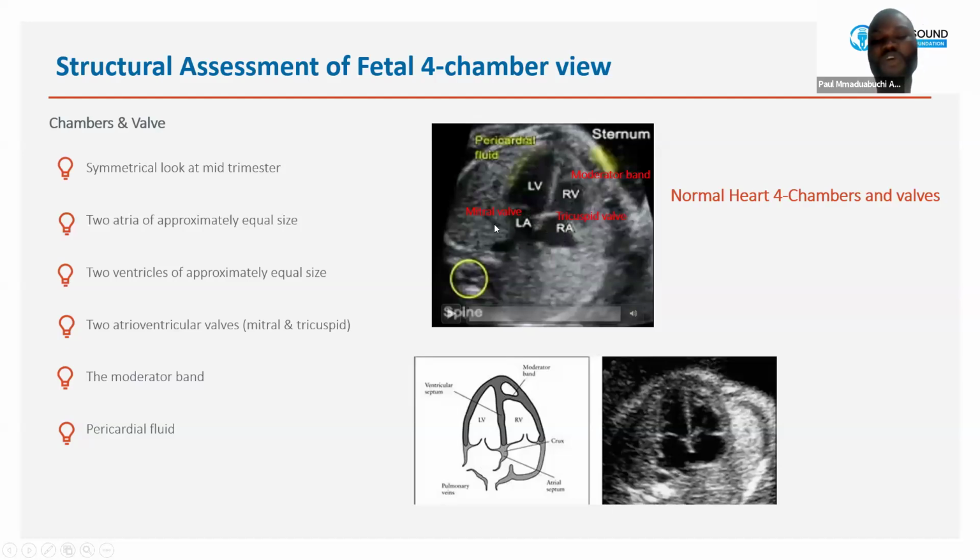In the heart, you will also notice a small fluid collection, which is the pericardial fluid. When it is small, it is a normal observation. This is a video showing the moderator band, the mitral valve, the tricuspid valve, and the pericardial effusion. This is one of the ways you could assess the chambers and the valves.